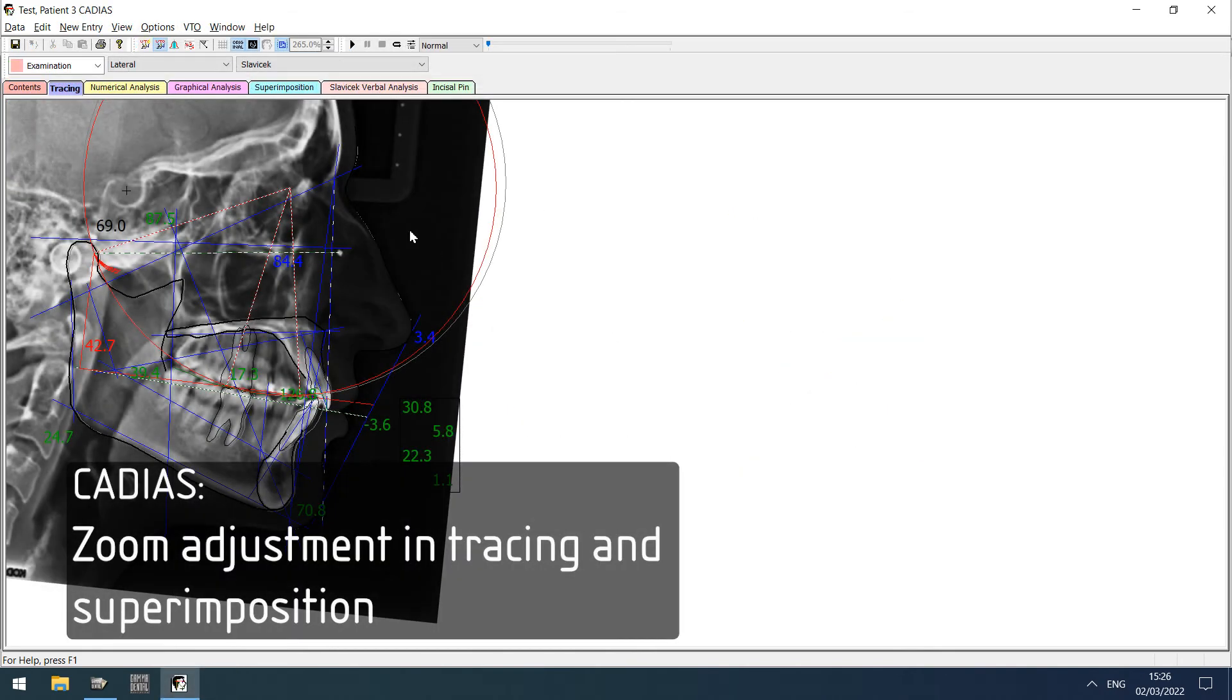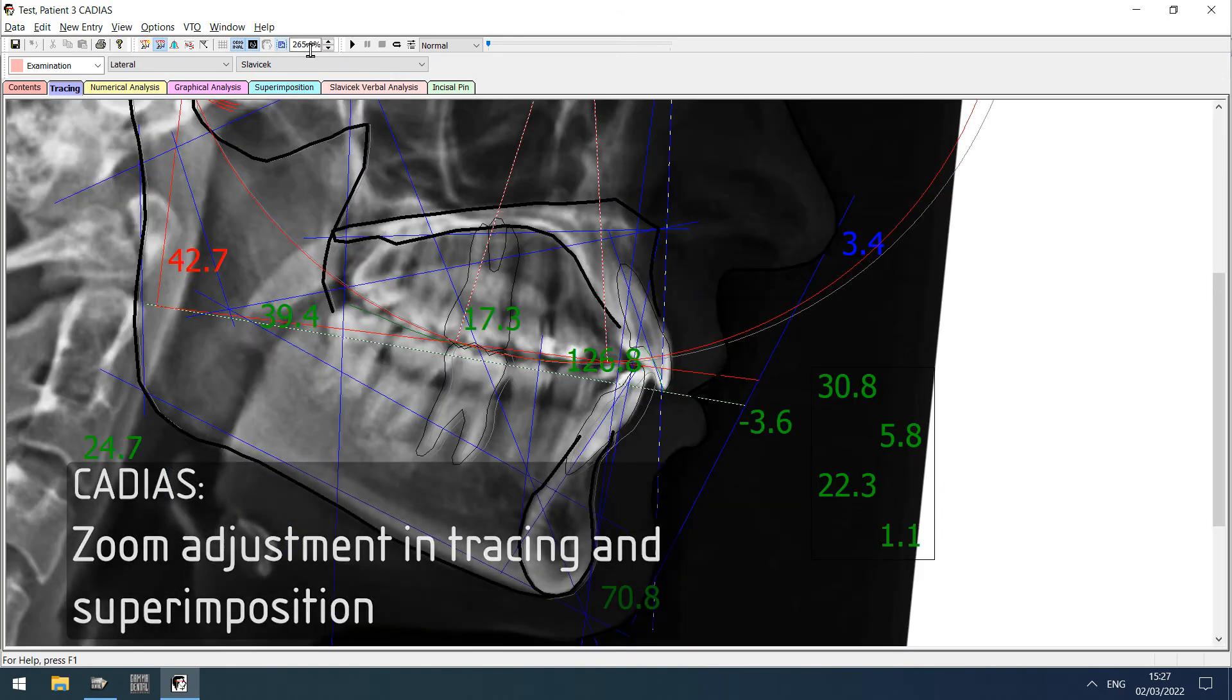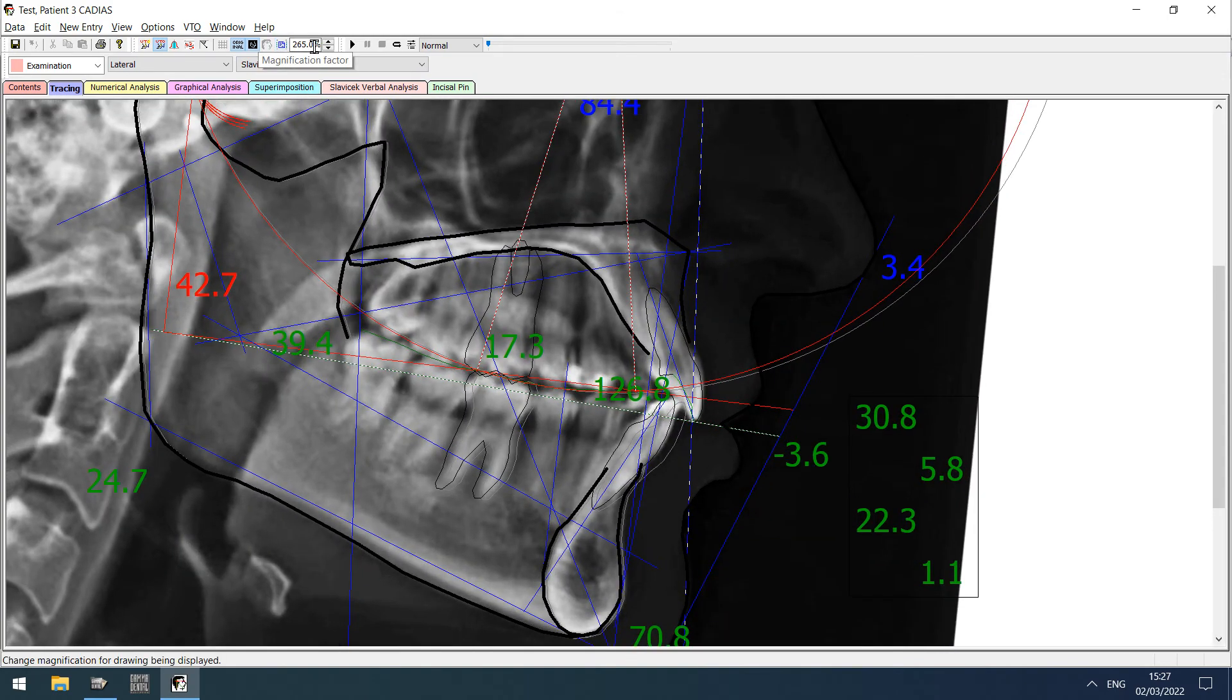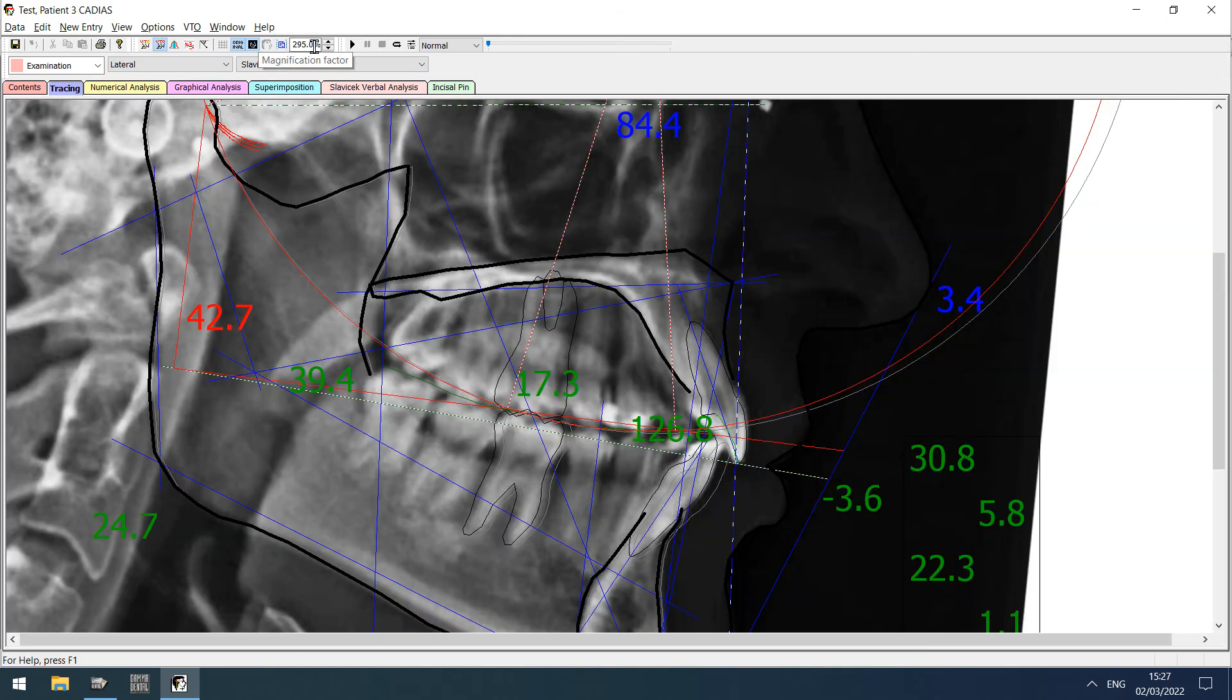In Cadiax Analyzer, it is now possible to adjust the zoom setting on the tracing and superimposition panes, similar to the adjustment in Cadiax applications.